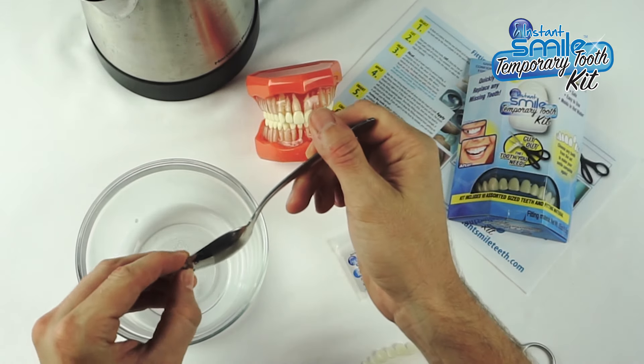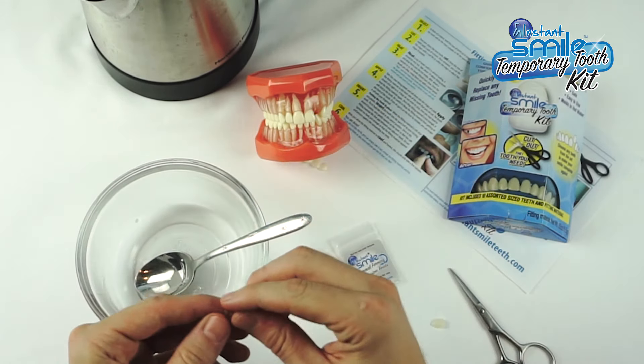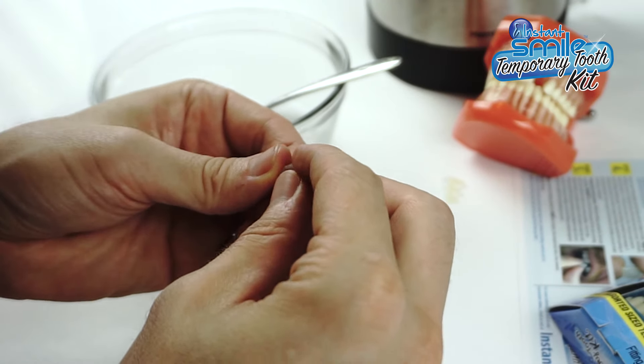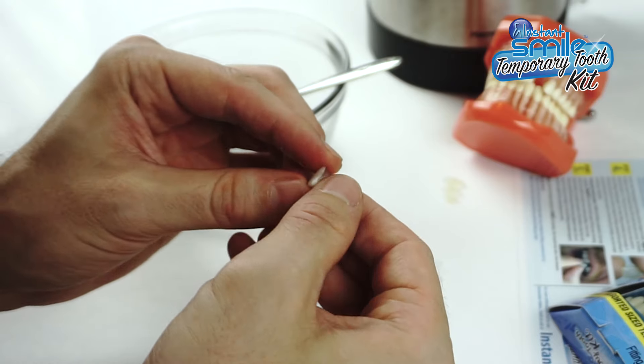Remove them from the cup with a metal spoon. Take a portion of the fitting beads and apply them to the back of the artificial tooth. The fitting material will bond itself to the plastic tooth.